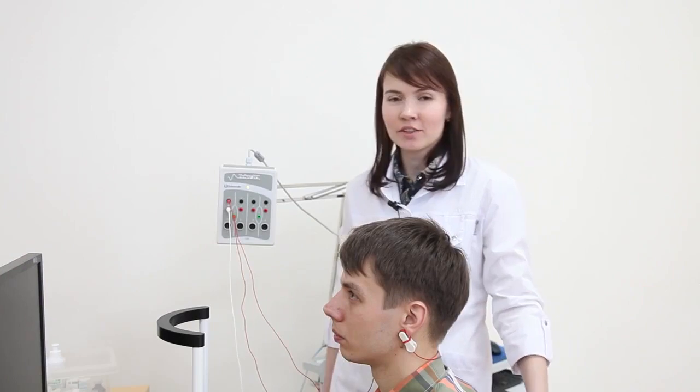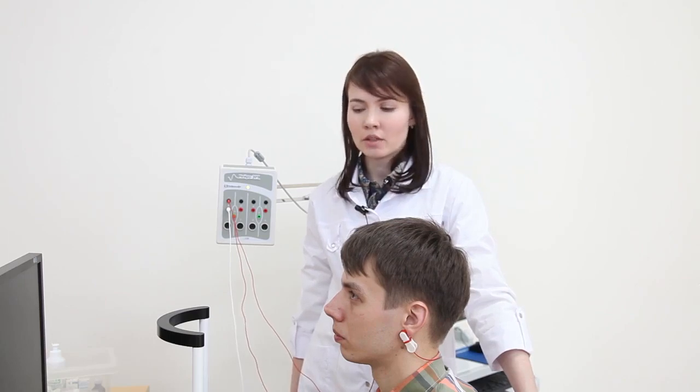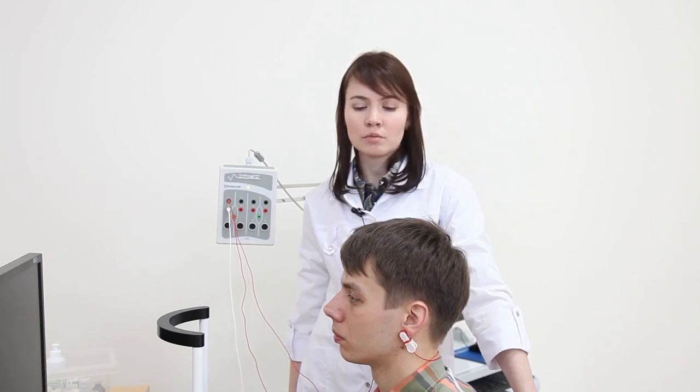During the multifocal ERG test, it is required to use the chin and head support assembly. It is done to minimize the patient's head movements and tension of muscles of neck and head. More important, during the stimulation, the patient should look at the fixation point and avoid blinking. When the stimulation cycle is over, the patient can relax, close their eyes or blink.